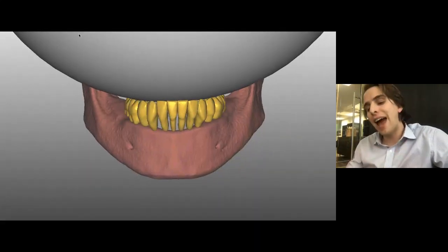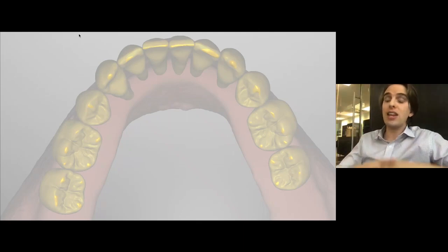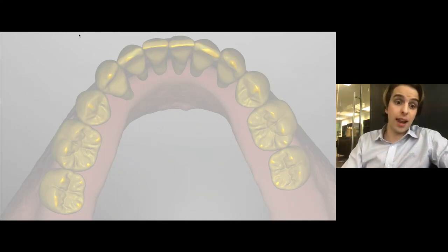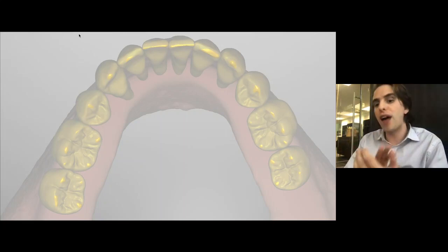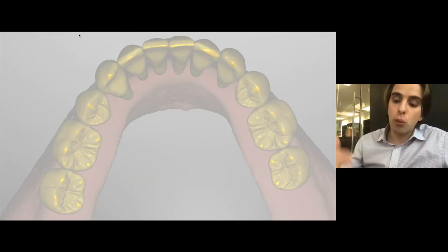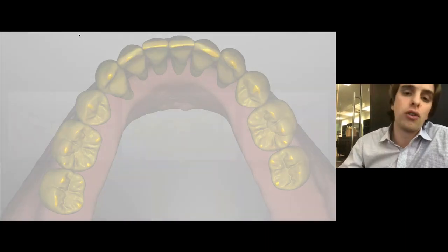And what we're getting at is essentially a formula where we will draw the blueprint, the engineering plans of our prosthetic before we go to place pillars in the mouth. I'm talking about pre-operatively fabricating the tooth setup in a patient-specific manner so that we can eliminate transmission errors and we can promote function and aesthetics and stability over the implants.